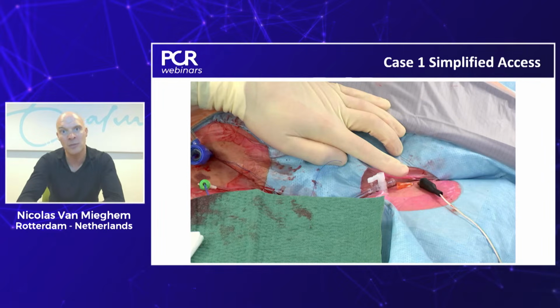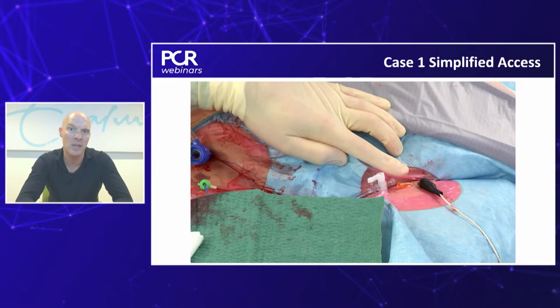So we have a radial access for cerebral embolic protection, filter-based protection, and then we have a single access right femoral, superficial, and common femoral artery. Is this something that you would also consider in Galway? Yeah, it's an interesting approach. I haven't seen it very often before. We would have our secondary access via the left radial artery and enjoy that, I suppose. But maybe you might tell us what do you think are the advantages, Nicholas, of that single common femoral and superficial femoral access compared to a left radial approach, for example?